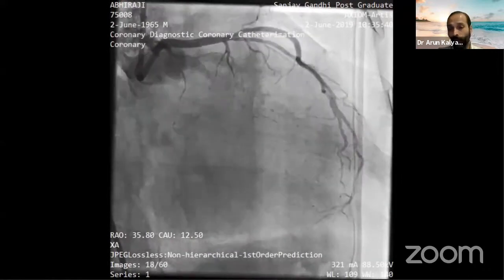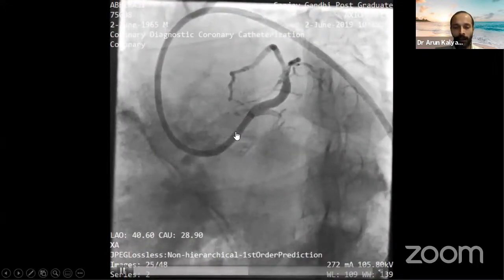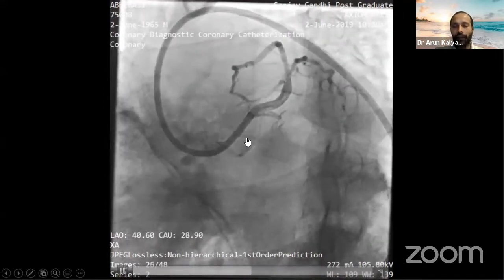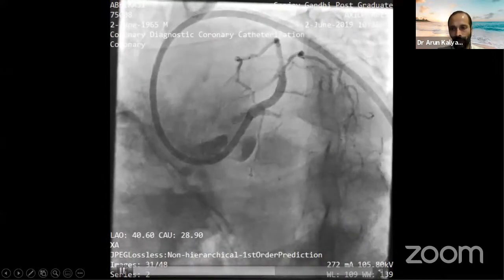This was an IVUS-guided CTO. This was actually for a live case. And you can see it here. There's nothing from the right side, in case anyone's wondering why you don't have a second guide, which is really a key thing, as Dr. Bang had said. There's an ambiguous cap. So we've kind of looked at the pictures here, right?